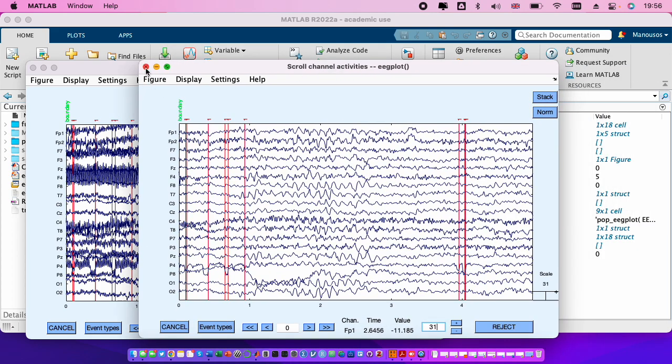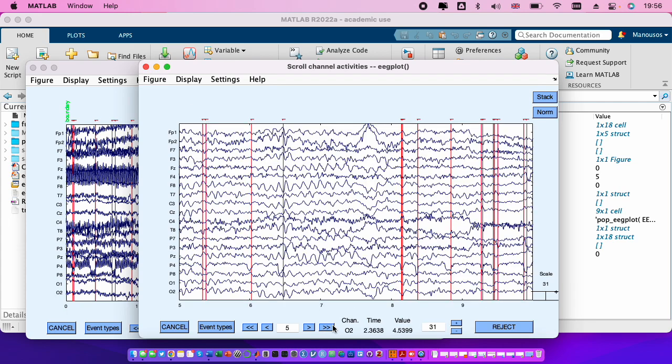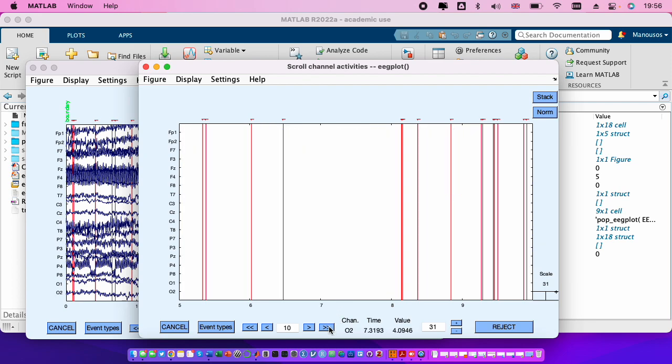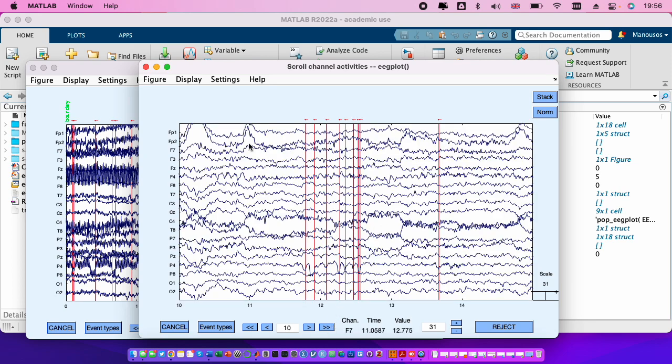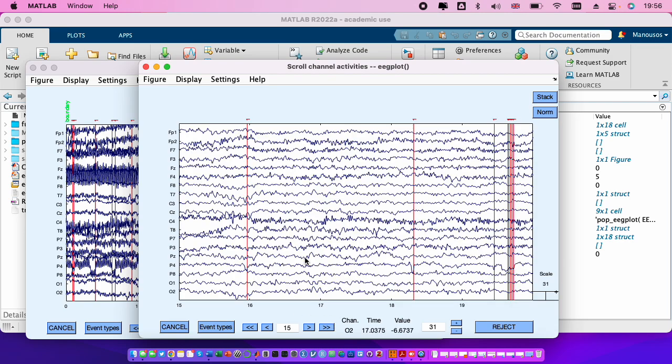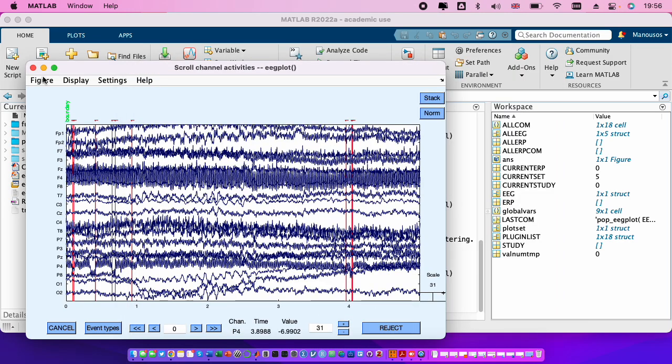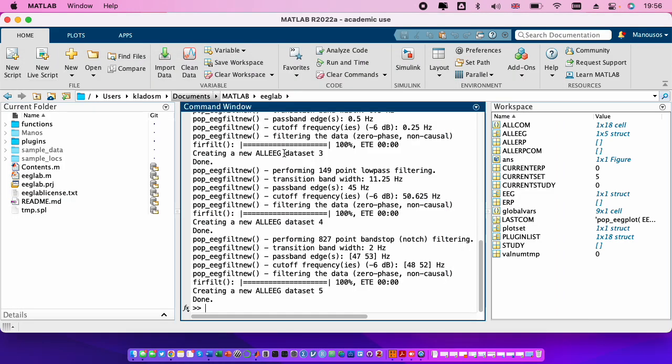Okay, so then if we scroll to the signals we see some artifacts like the blinks here, like some puffs here, blinks or horizontal eye movements, and then we need to remove these artifacts.